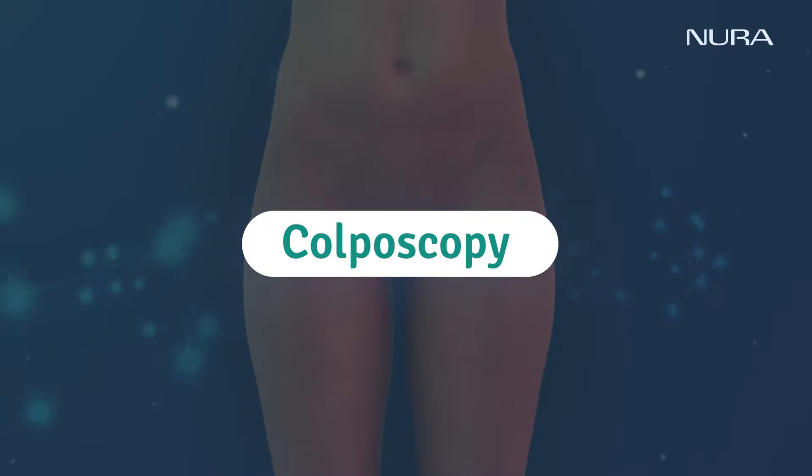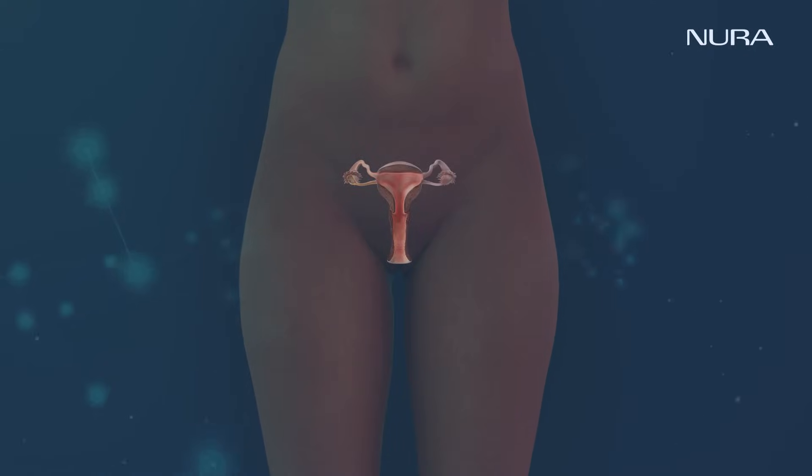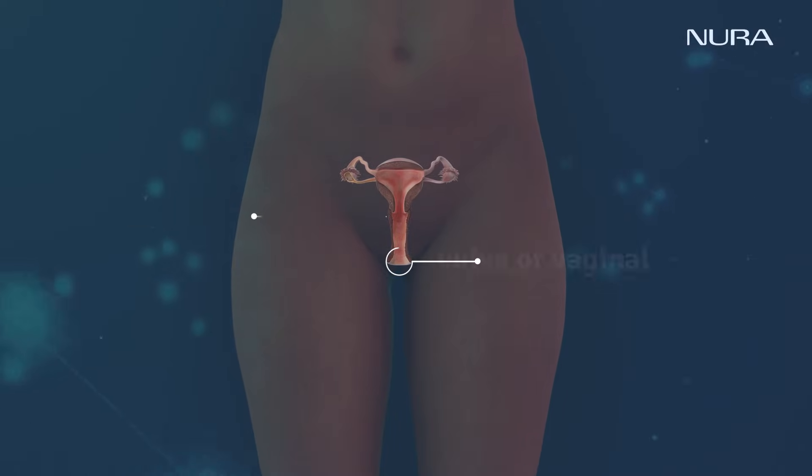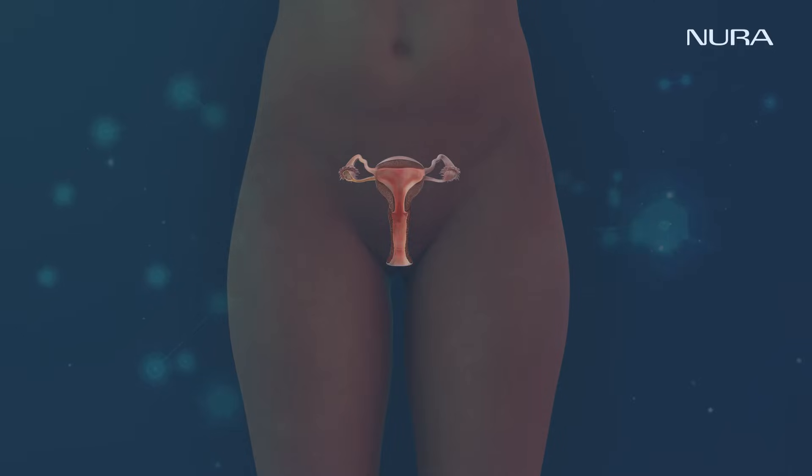Colposcopy is a gynecological procedure to examine any abnormalities in the cervix, vulva, or vaginal area, including inflammation, injuries, or cancerous growth.